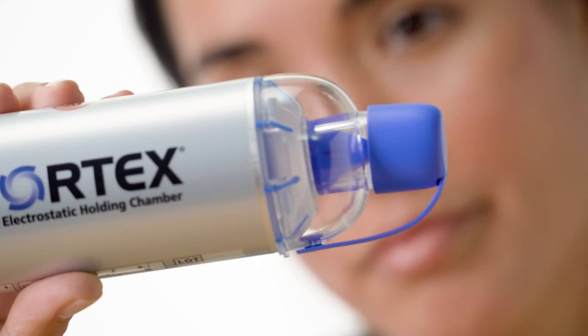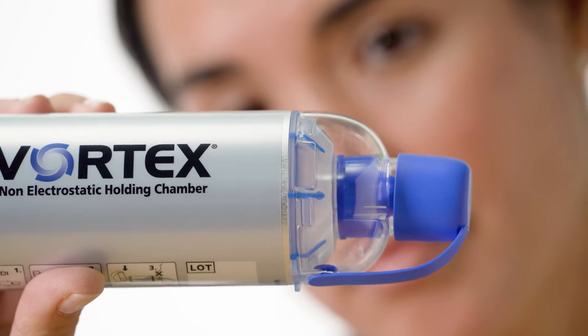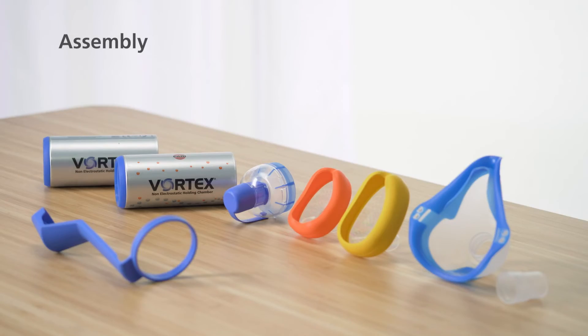Check that there are no foreign bodies on or in the holding chamber and ensure that the valve is closed. Once you've checked the individual parts, you can start to assemble them.